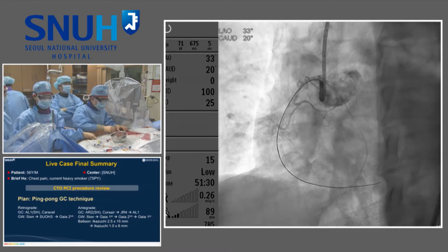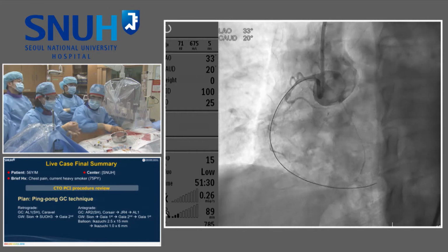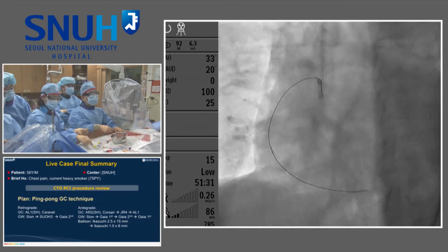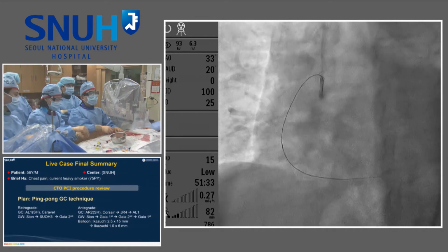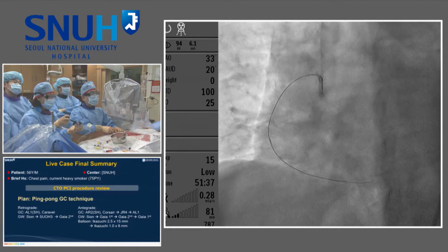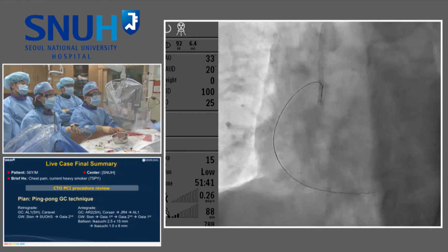No, Dr. Kim, Dr. Finkelstein's question is if you have to do it through a channel from the left main, LAD or septal collateral, what protections do you take to make sure that LAD is not dissected, or how do you protect it? I mean, not in this particular patient, in general.